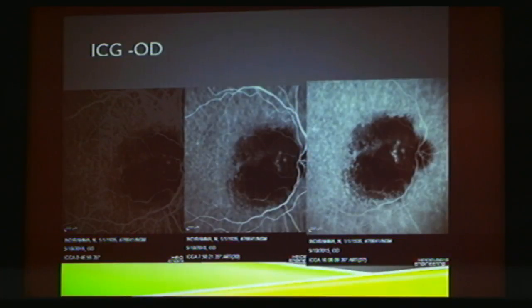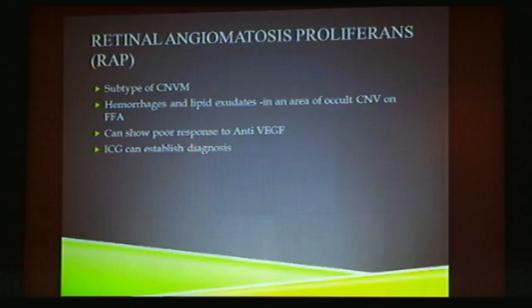Maybe with advancements in our imaging technologies, OCT angiography may prove to be better than ICG. But as of today, ICG still is the modality of choice to study PCV, diagnose, study and follow up patients with polypoidal choroidal vasculopathy. Few words about RAP.